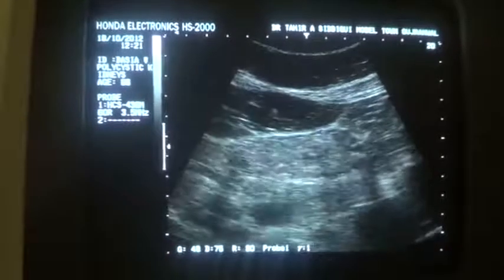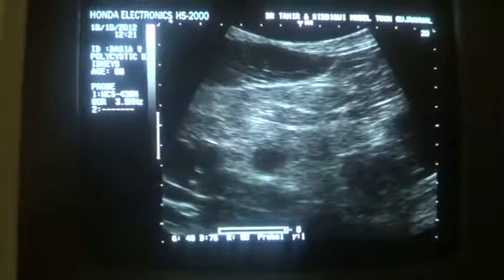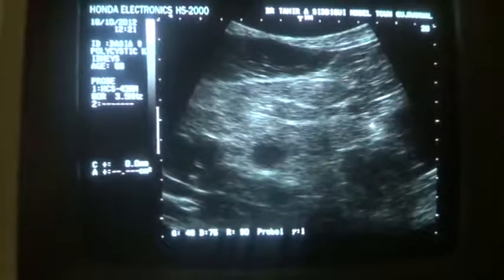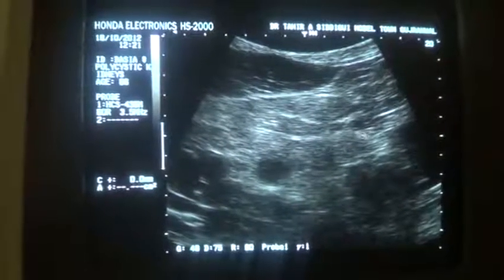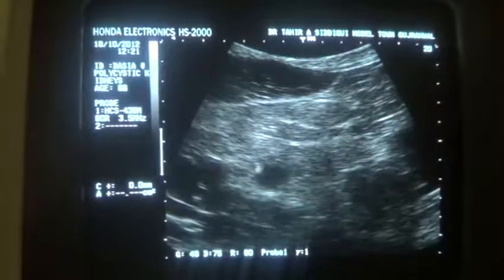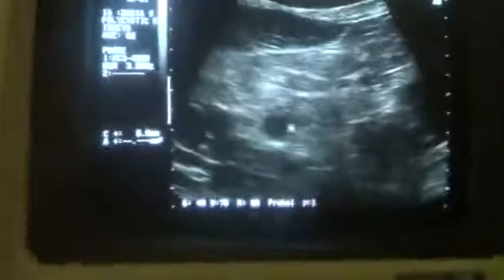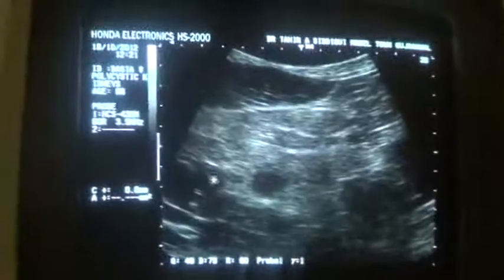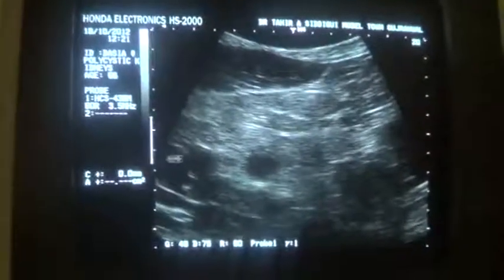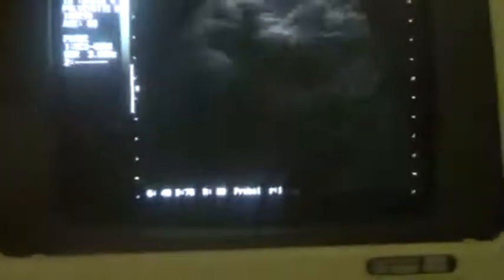And this is the pancreas. There are no cysts relating to the pancreas. This is the superior mesenteric vein. And this is the splenic vein. This is the transverse section of the right kidney showing cysts.